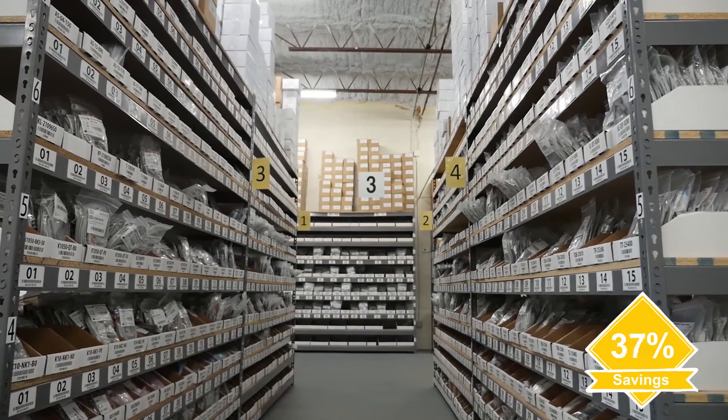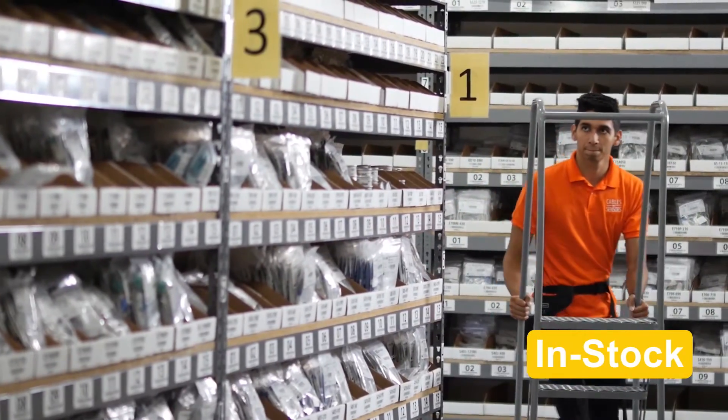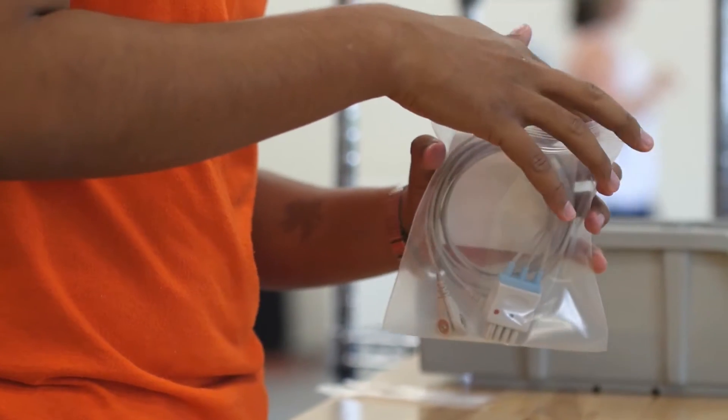Cables and Sensors saves you up to 50% over the OEM. 99% of our orders are in stock and ship immediately. All of our products meet or exceed the original manufacturer's warranty.